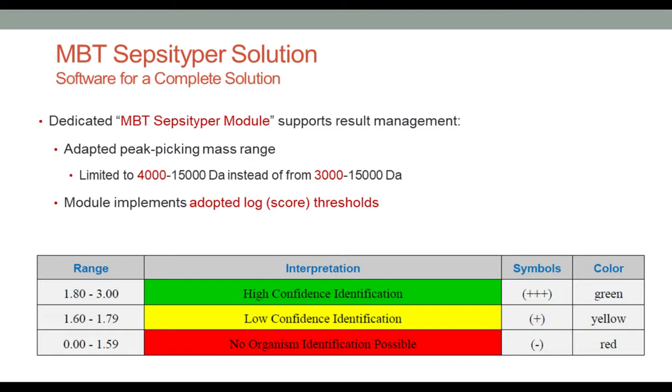Was a verification required for each of your blood culture bottle types or in multiple facilities? Yeah, so all of our blood cultures are sent to one location. The bottles are sent here. There was a big discussion about whether we should keep them at the sites or have them all sent to one place.